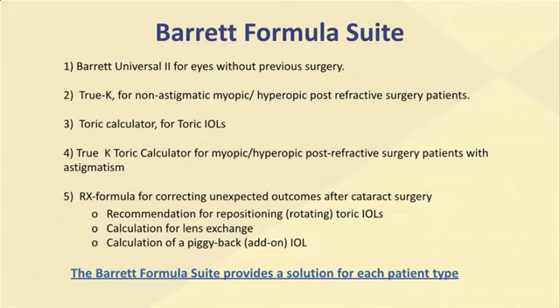You know, I still do use the ASCRS calculator. I'm sure many of you do for post-refractive eyes. But this actually has a number of post-refractive formulas on there, which reduces the need to use the website. There's always an issue with transferring data on a website, which can result in errors.